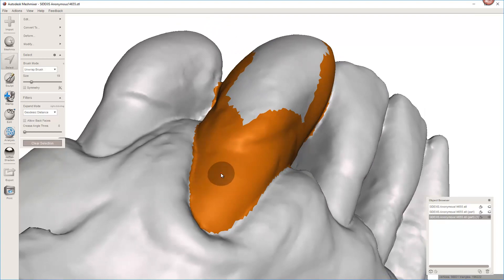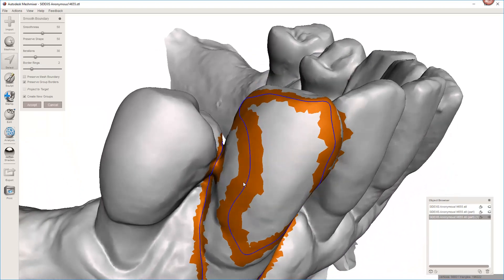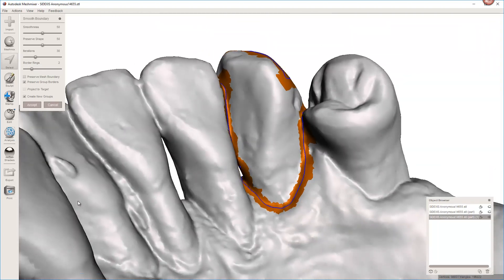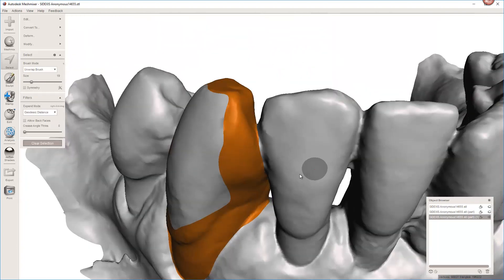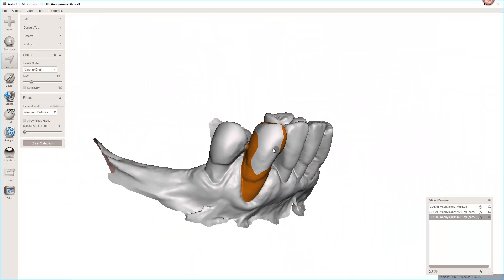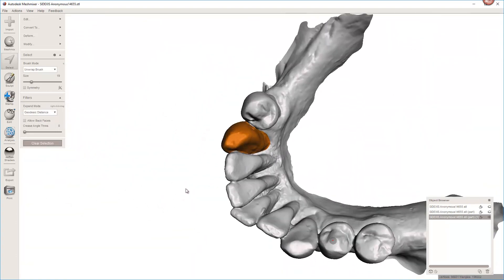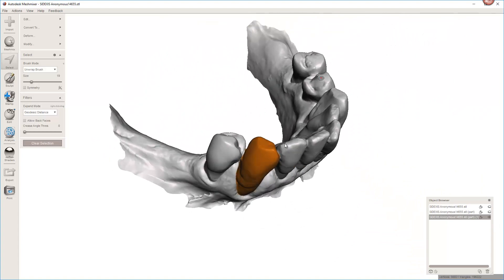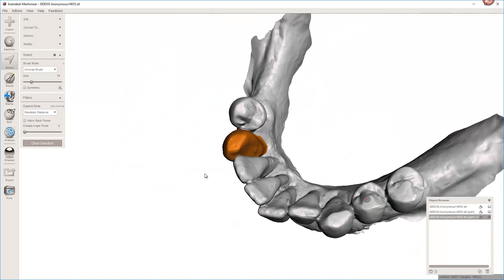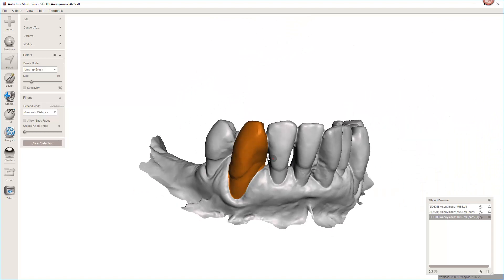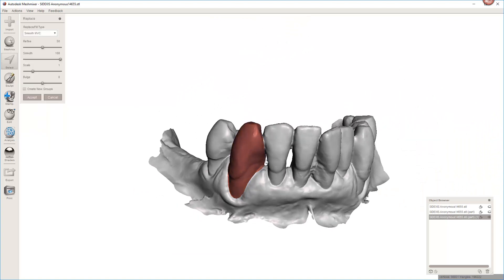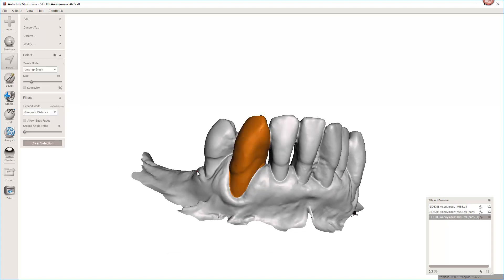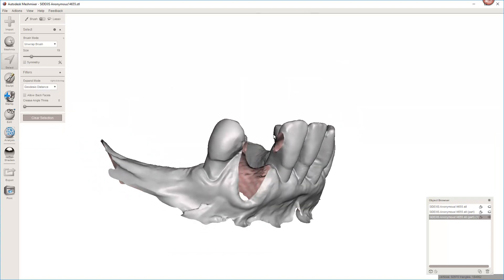Now, if I hit the B button to smooth my boundary, I get a nice smooth selected area. Hit OK. And now I can just double click right here and it selects all of that. That's why I mean in a case like this, it wouldn't take me too long. So now what we used to do is hit F to erase and fill. And it does not like this because there's the disjointed area here. So instead, I'll just hit delete.